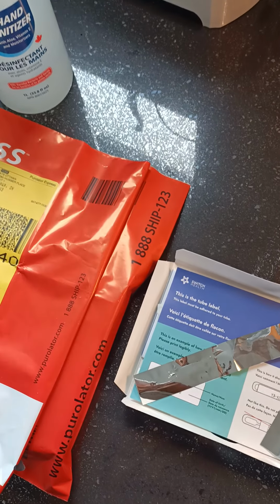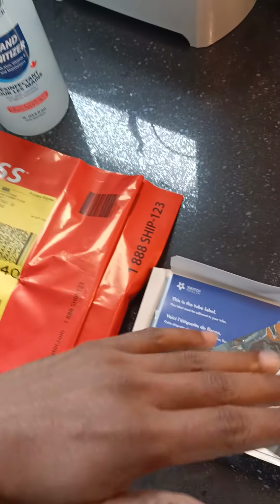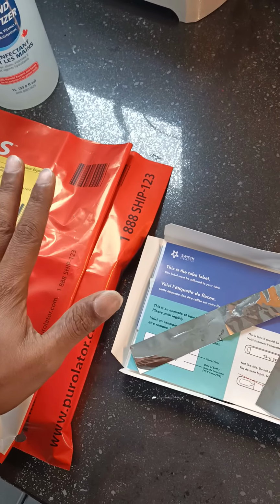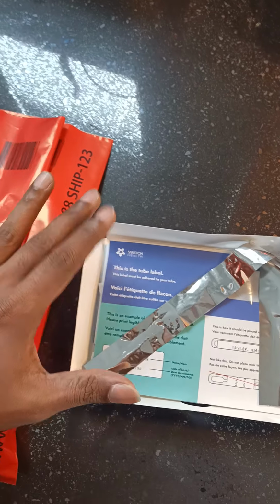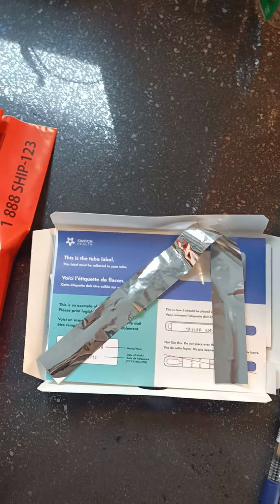So now, while continuing with the quarantine, on day 8, which is the first 3 days plus another 5 days of quarantine, we have to do this test. For this test, the kit we have to do ourselves. There is a Switch Health website link in the Canada immigration site. You have to go there and create an account of your own.